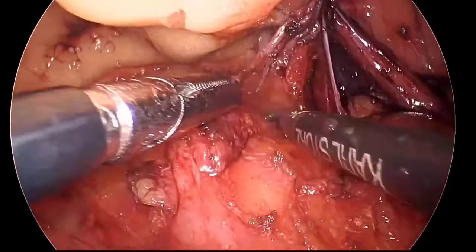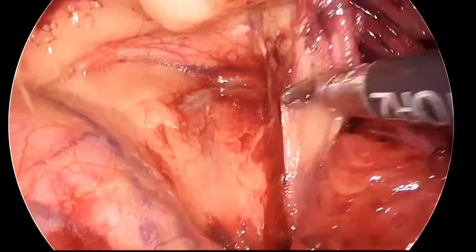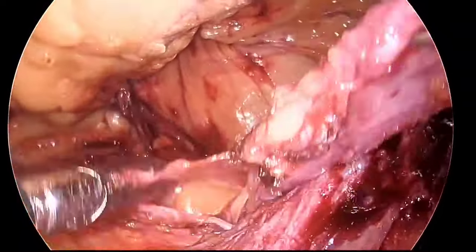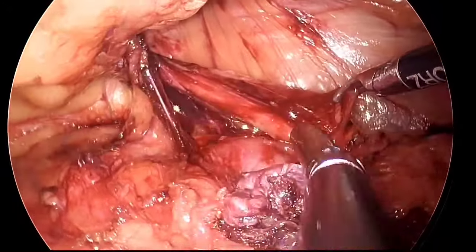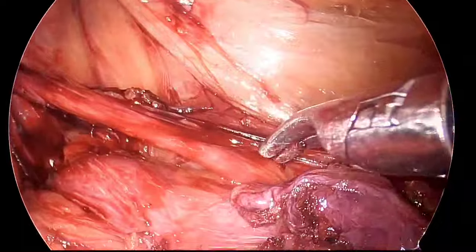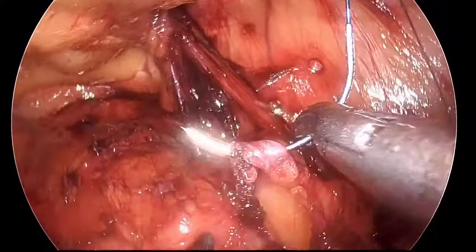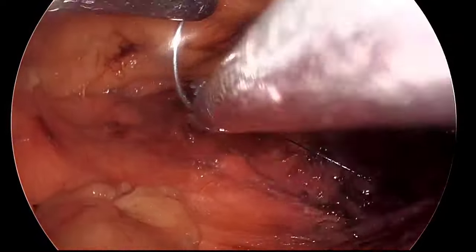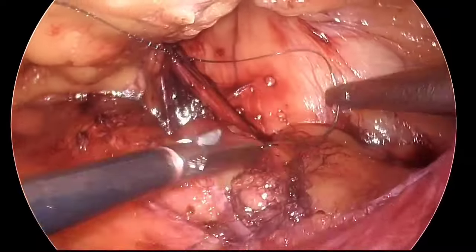So you can see this is in continuation of achieving the myopectineal orifice, parietalization of the sac. Now you can see the divided margin of the sac, the gonadal vessels and the vas deferens. Lateral is the gonadal vessels, medial is the vas deferens. Both of them are safeguarded. Now I have taken a 3-0 V-Loc suture to close the peritoneal rent.